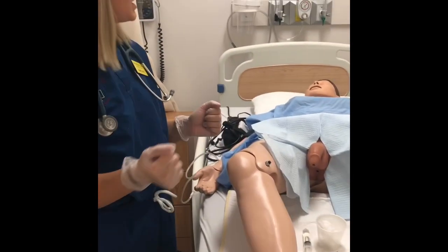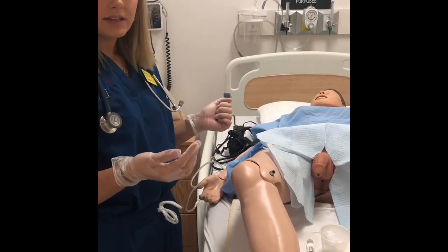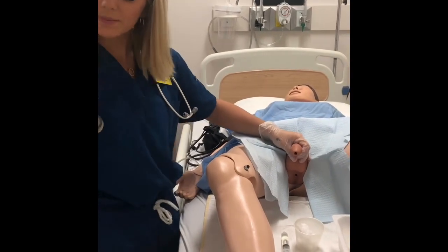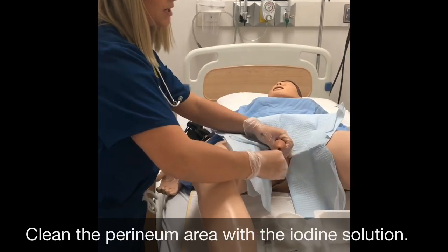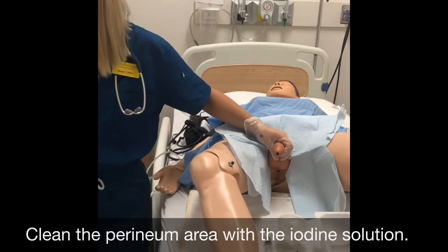Okay, so I'm preparing to clean Mr. Mancini's penis with the iodine solution. So I'm going to grab the penis and grab my forceps. And I'm going to grab a cotton ball that's dipped in the iodine solution, and wipe the penis 3 times in a circular motion going the same direction, and dispose of it.